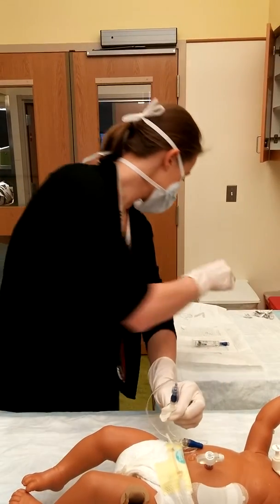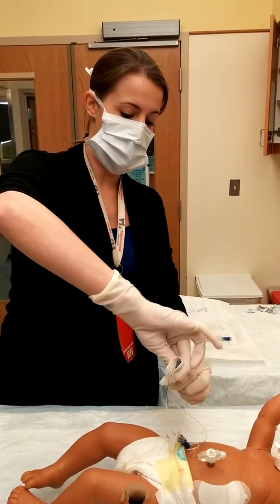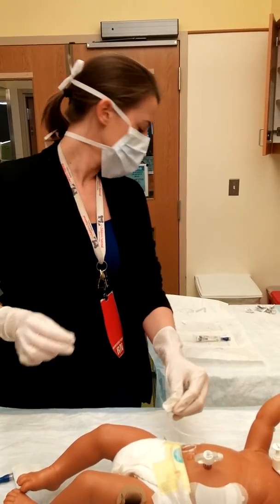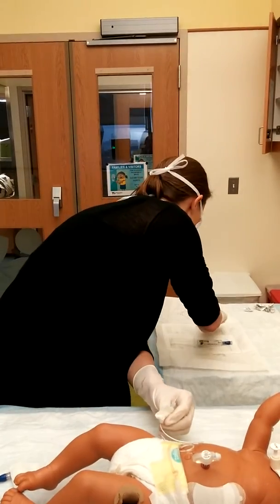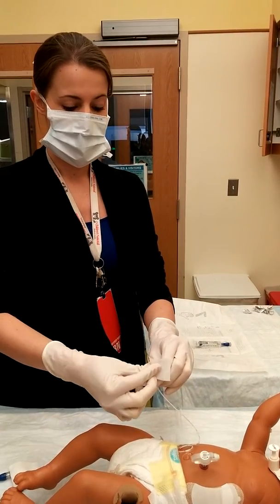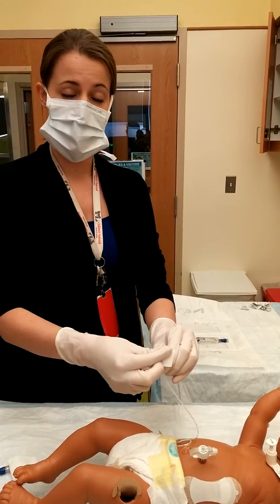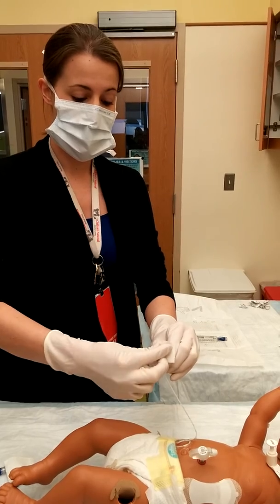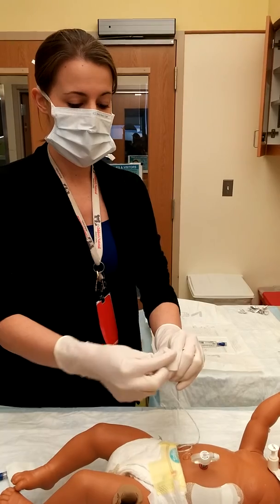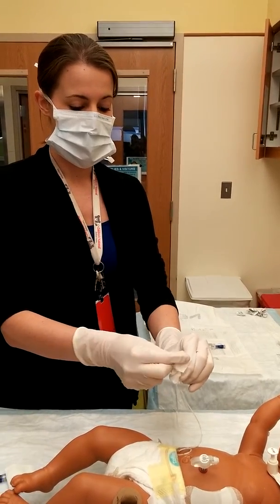Once the 30 seconds has passed, take your other sterile gauze and remove your cap. Then take your sterile CHG pad and swab and rub with friction around the hub, making sure not to introduce any chlorhexidine into the hub itself. You want to swab around the lumen, but not inside. Swab for 30 seconds using good friction.